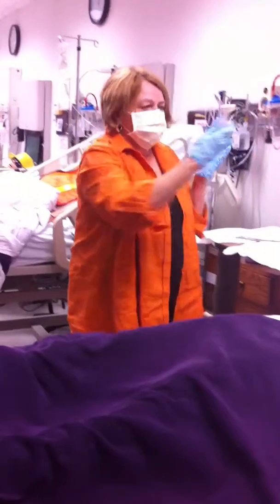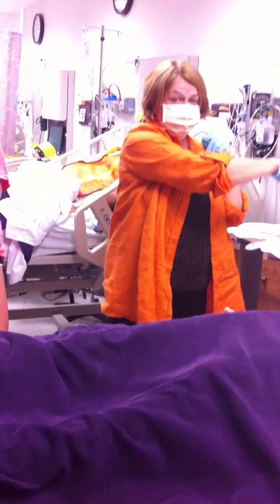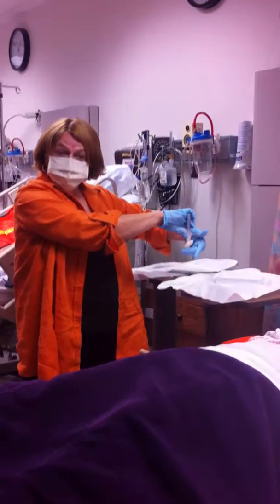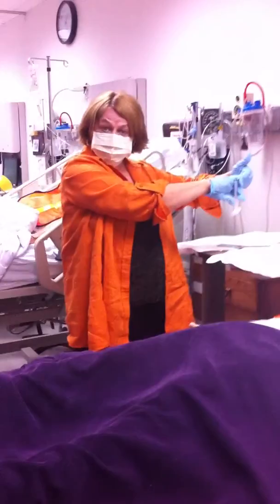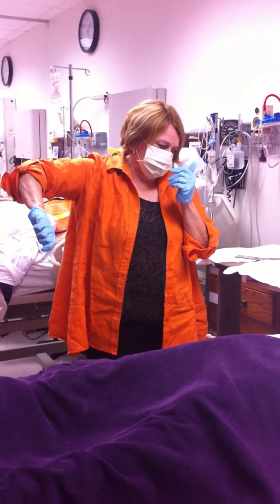And this chlorhexidine, I've got to activate it. I don't hold it here, because if I do and it drips, then that principle of sterile technique referred to as wicking is where fluid can wick up through. Okay, and now I'm ready.